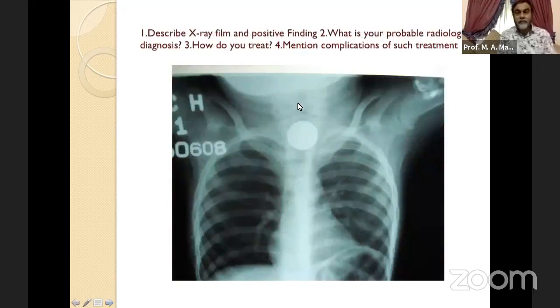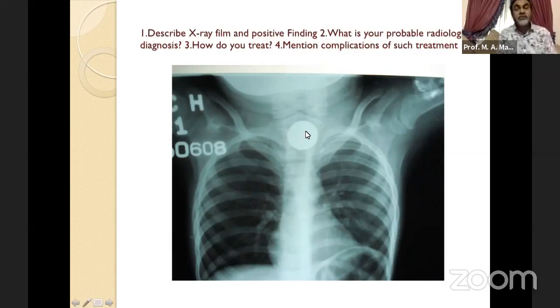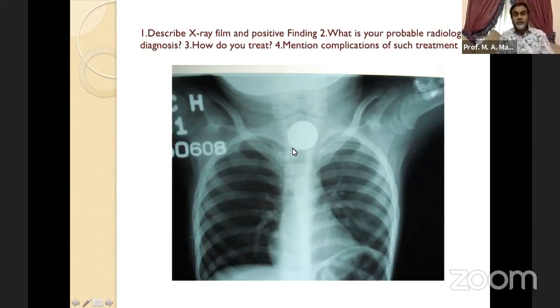Another X-ray: plain X-ray neck and chest, anteroposterior view, showing a large circular radio-opaque shadow in the root of the neck. Diagnosis: foreign body — most likely a coin in the hypopharynx or esophagus, to be confirmed by lateral X-ray. Treatment: endoscopic removal of foreign body under general anesthesia. Complications of esophagoscopy under GA: injury to teeth, tongue, pharynx, or esophageal perforation, which is a serious condition leading to mediastinitis.